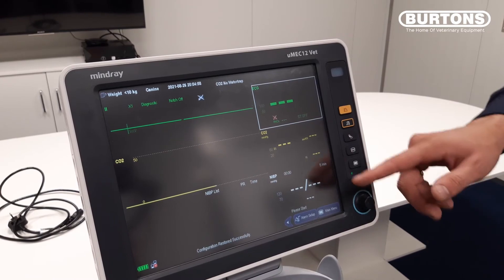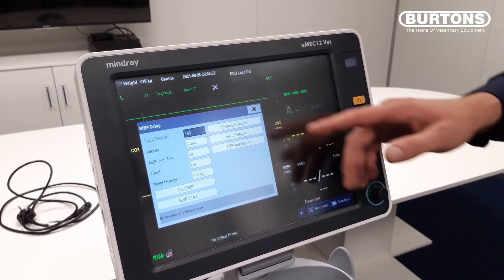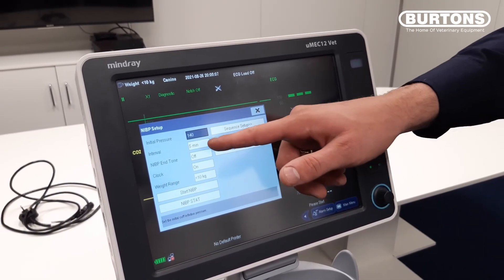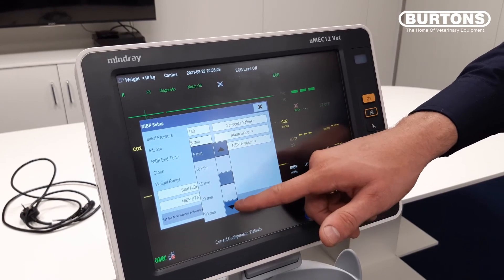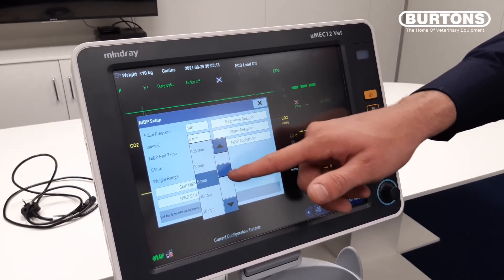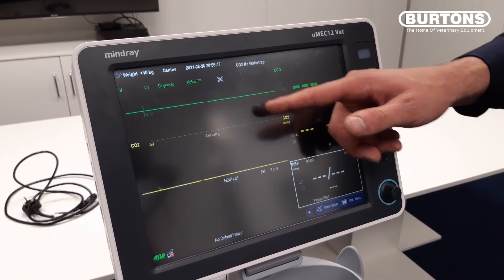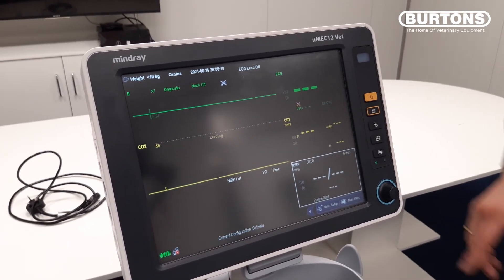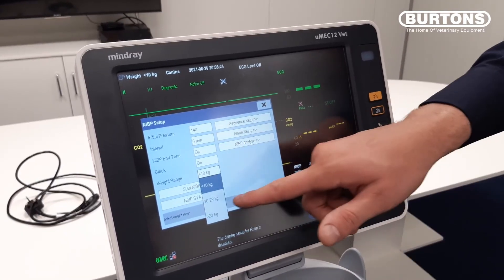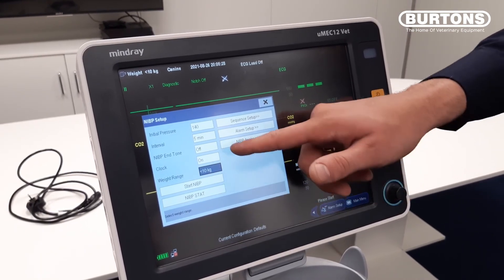For example, if we were to change our interval time on the blood pressure, we can do that by simply pressing on the blood pressure at the bottom and we can change our interval time to how we like it. Most people usually leave it on five minutes. Another thing we can also change is the weight range, and we can do that by selecting the drop-down menu.